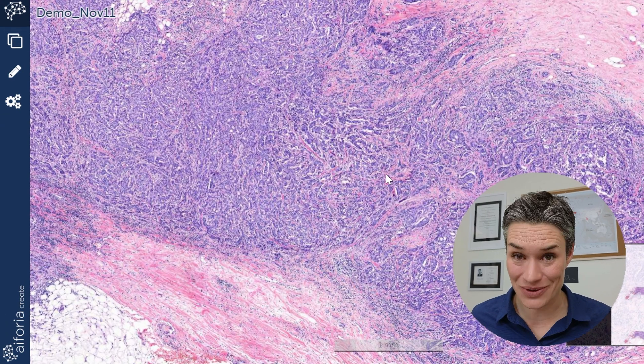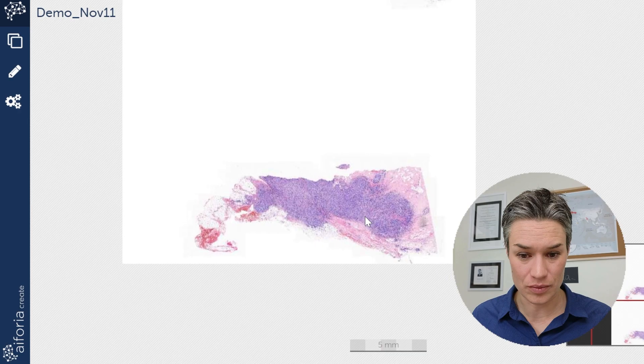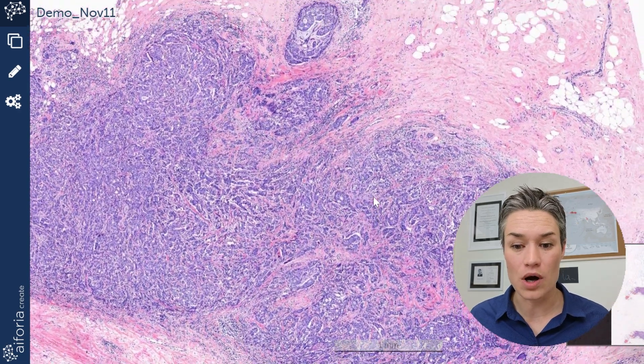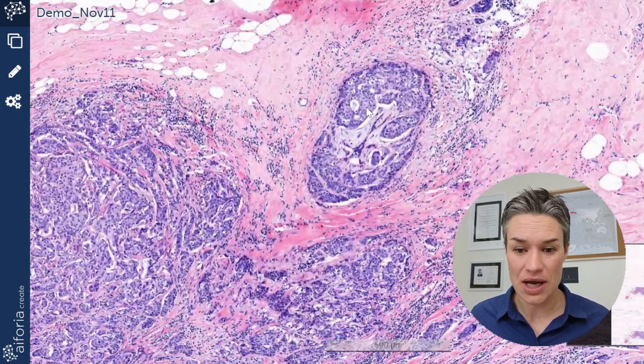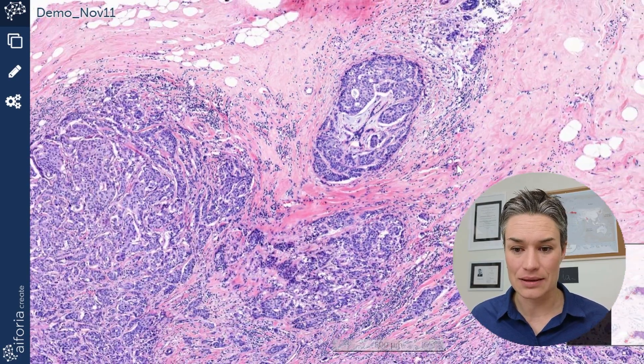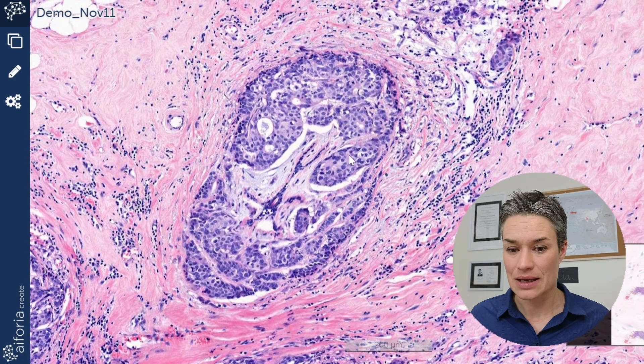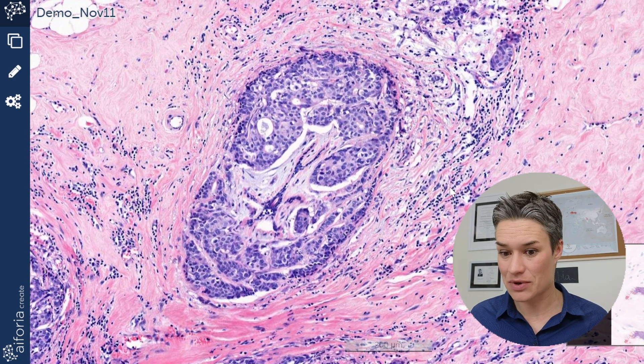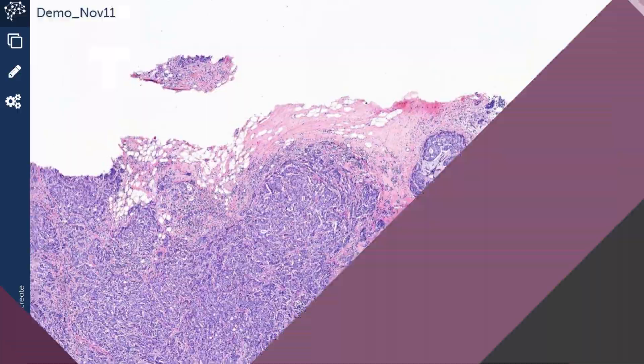On this slide we have a tumor in this tissue, and we need to define what we want to annotate. Do we just annotate this tumor and the rest, or do we annotate the tumor, stroma, immune cells, and then the rest? We have to define which exact elements we're going to annotate — these are our classes — and define the appearances of each element per class. We do this in a ground truth document that we keep consistent throughout the project.